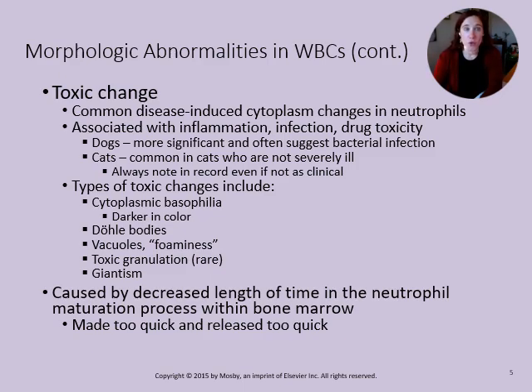So for dogs, our canine patients, this is going to be more significant, and it's often suggestive of a bacterial infection. Unlike in our cat patients, we can see these more commonly in cats, and they're not going to be clinical or severely ill, unlike what we would see with a dog. Cats are a little more hardcore, I guess. But we're always going to note anything in the medical record if we see anything.